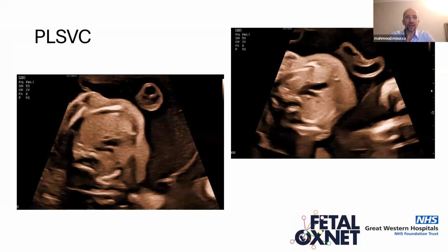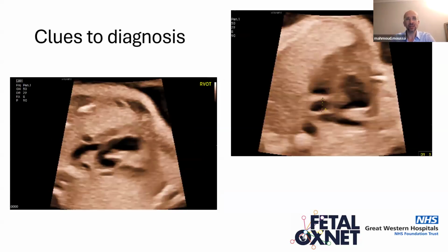So if you look at the image here, you can see that in that view, there is another vessel on the left of the pulmonary artery, which you shouldn't be getting. So actually you've got an SVC on the right, but there is another small vessel on the left. So these are 4 vessels here. So these are 2 superior vena cavas, or what we call a persistent left superior vena cava. The left superior vena cava usually becomes atretic in the majority of fetuses, and you should not be seeing them during normal cardiac examination.